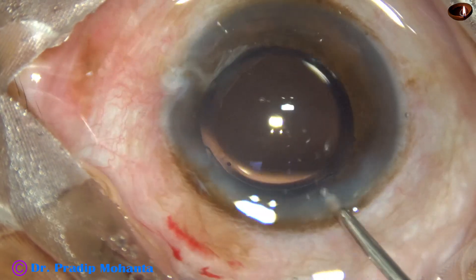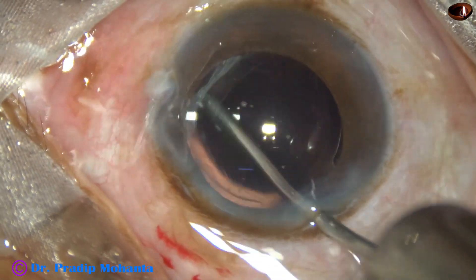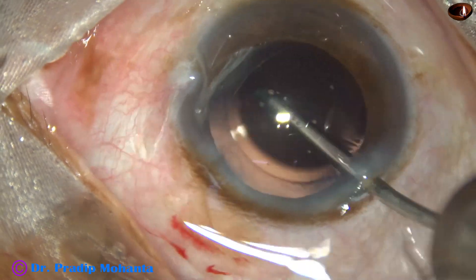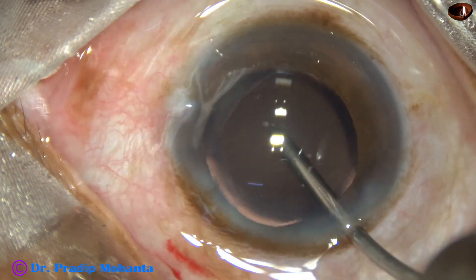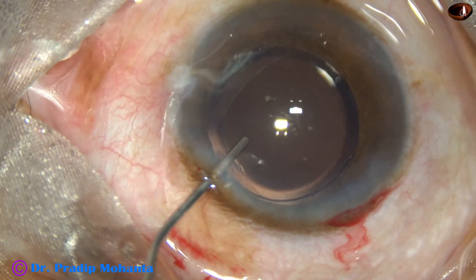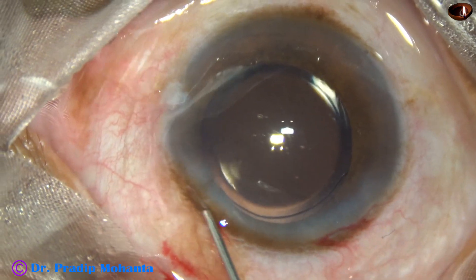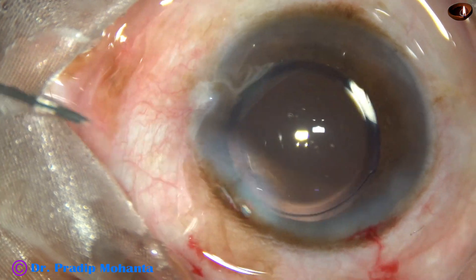In this case, the IOL was placed in the bag. The case is nicely done and now a bit of moxifloxacin is applied. The side port is closed by hydrating corneal stroma.